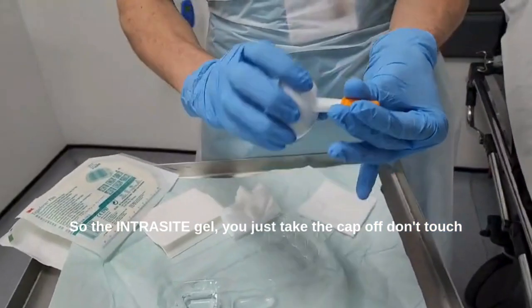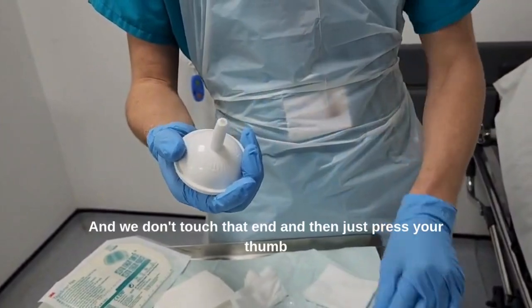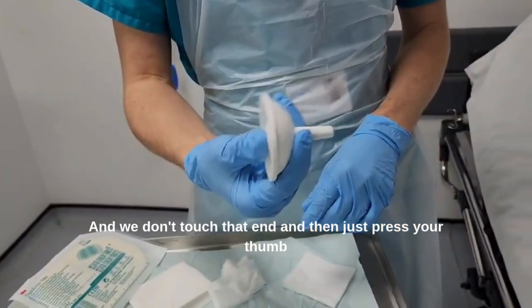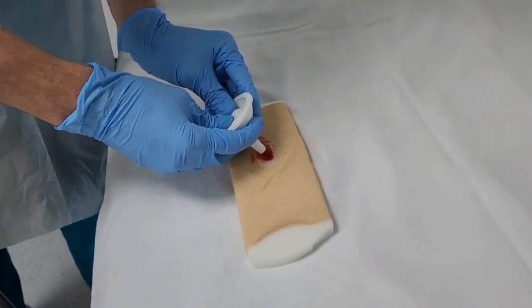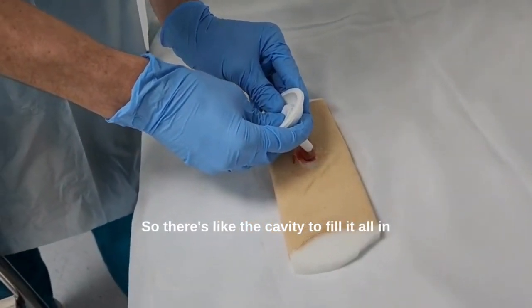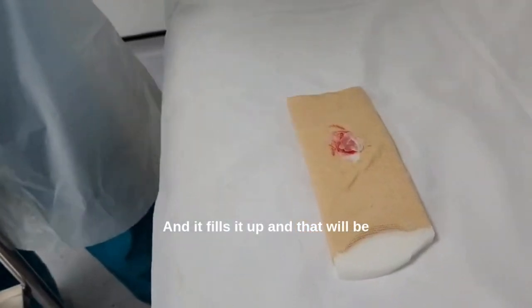So with the Intrasight Gel, you just take the cap off. Don't touch the end of it — apart from to take this off, it snaps off. And then you just press your thumb and you're just filling the hole of the wound — almost like filling a cavity to fill it all in.